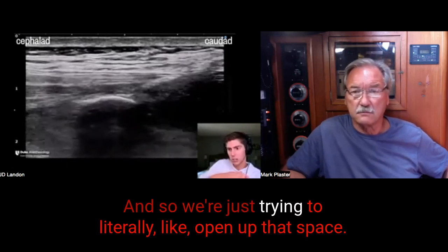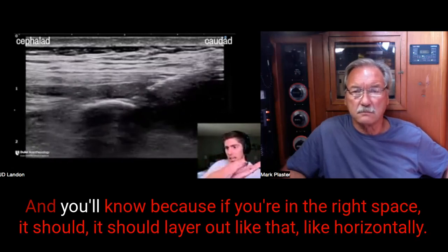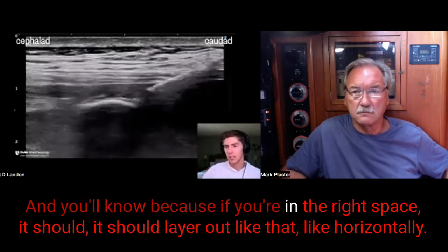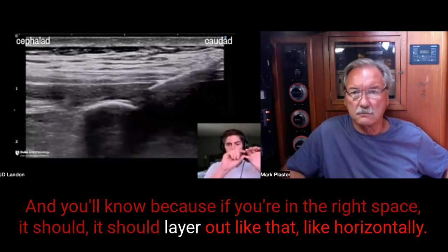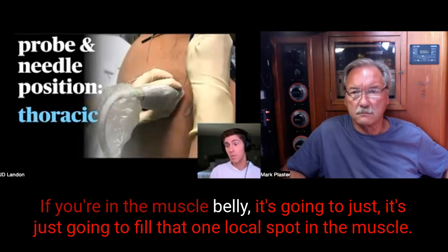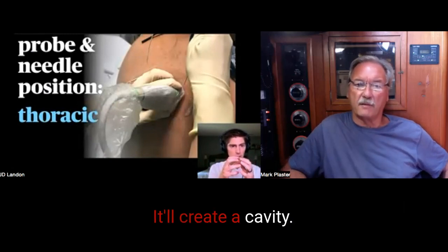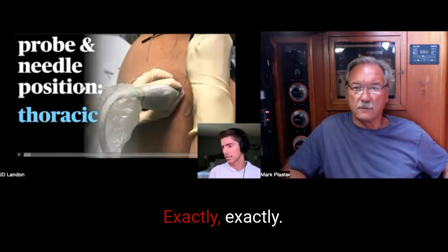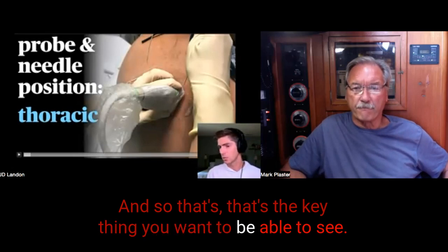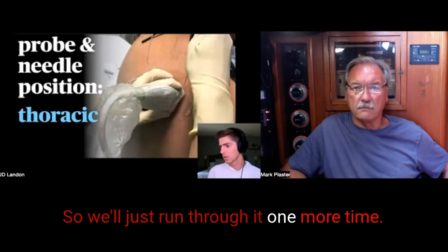And so we're literally just trying to open up that space, and you'll know because if you're in the right space, it should layer out like that, horizontally. If you're in the muscle belly, it's just going to fill that one local spot in the muscle. You'll create a cavity. Exactly. And so that's the key thing you want to be able to see. I think I've got one more. Nope, that's it.